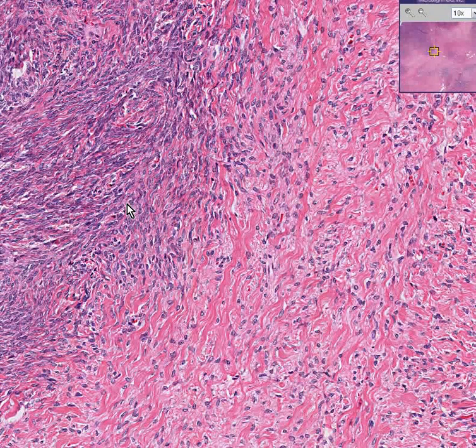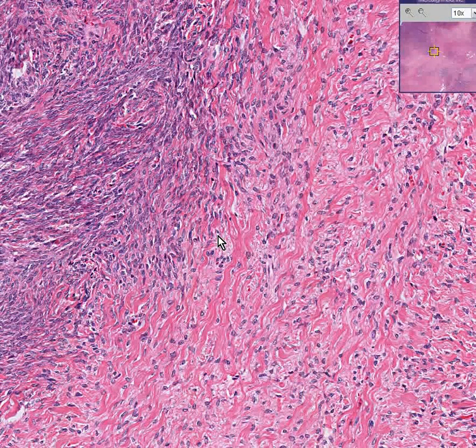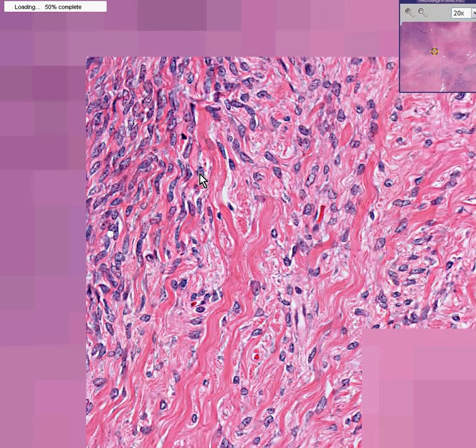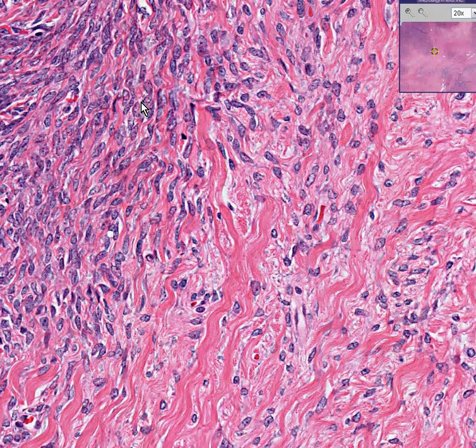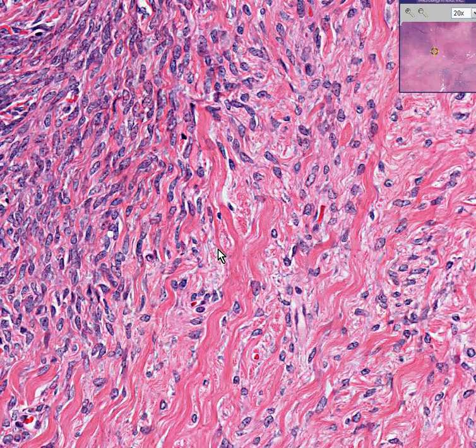The stromal ovarian tumors are a lot like the stromal testicular tumors — they're almost never malignant. And they certainly don't look malignant here. They all look like they have nice, mostly spindly nuclei that look a lot like each other. They're not darker than they should be, and they're not necessarily that variable with respect to each other. They simply look benign. This is a benign theca cell tumor of the human ovary. And I thank you very much.